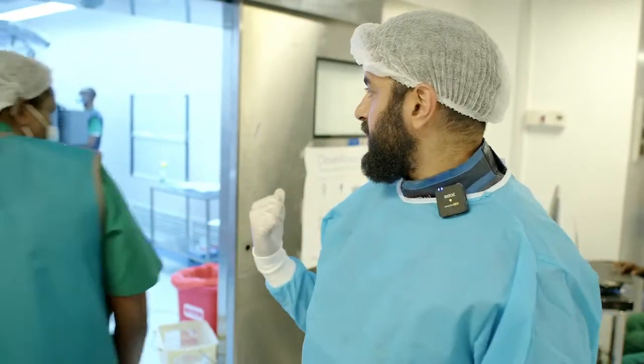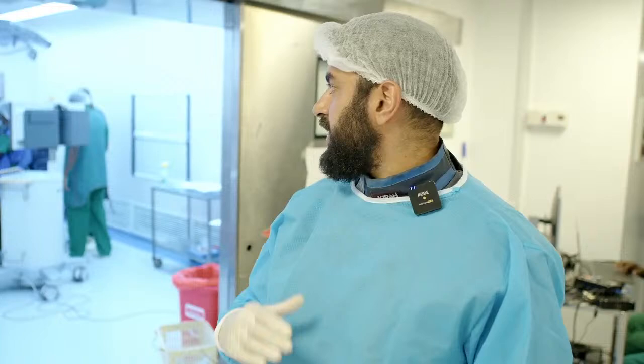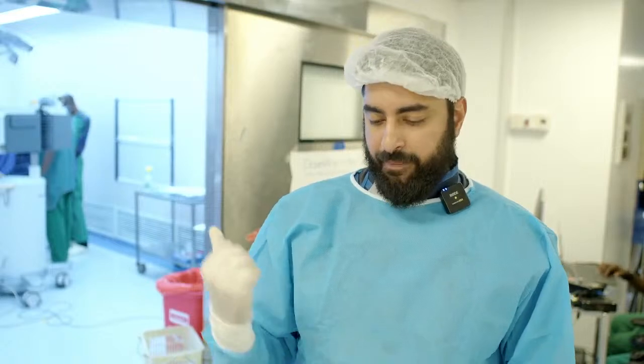So our patient is on the table. She's already being sedated. The timeout has already been done. And we're going to put in an ET tube size 8, which is a large ET tube. We want a size 8 tube because it gives us enough space for the bronchoscope, the probes and the balloon to fit comfortably. Otherwise it's all going to get clogged in there.